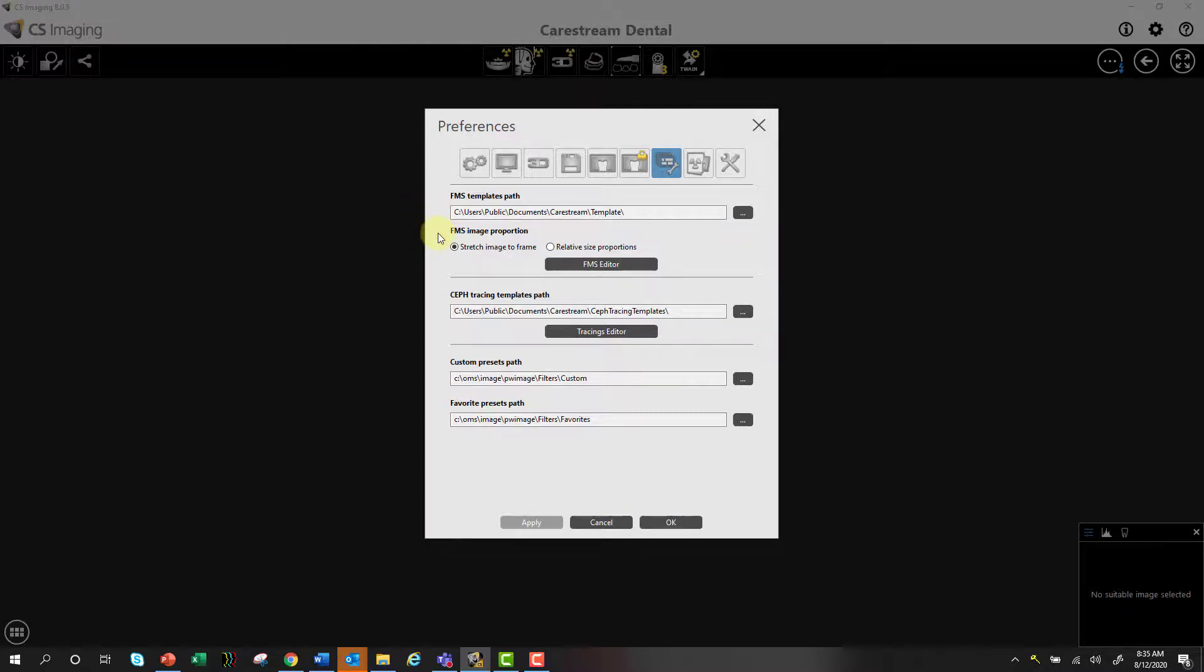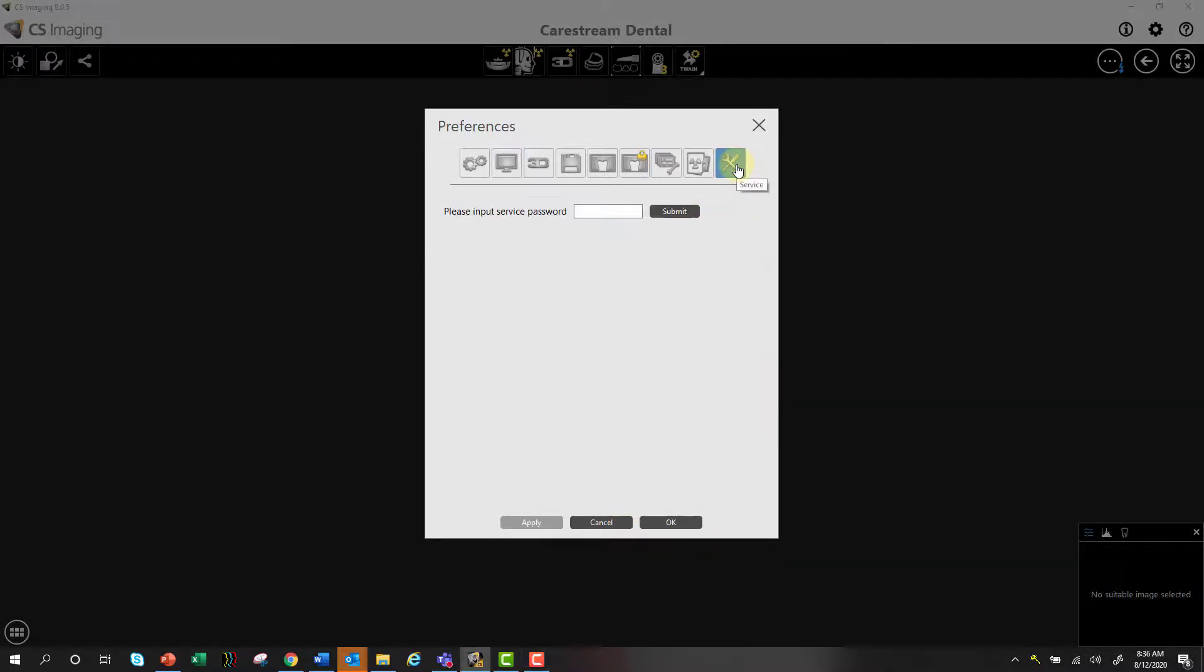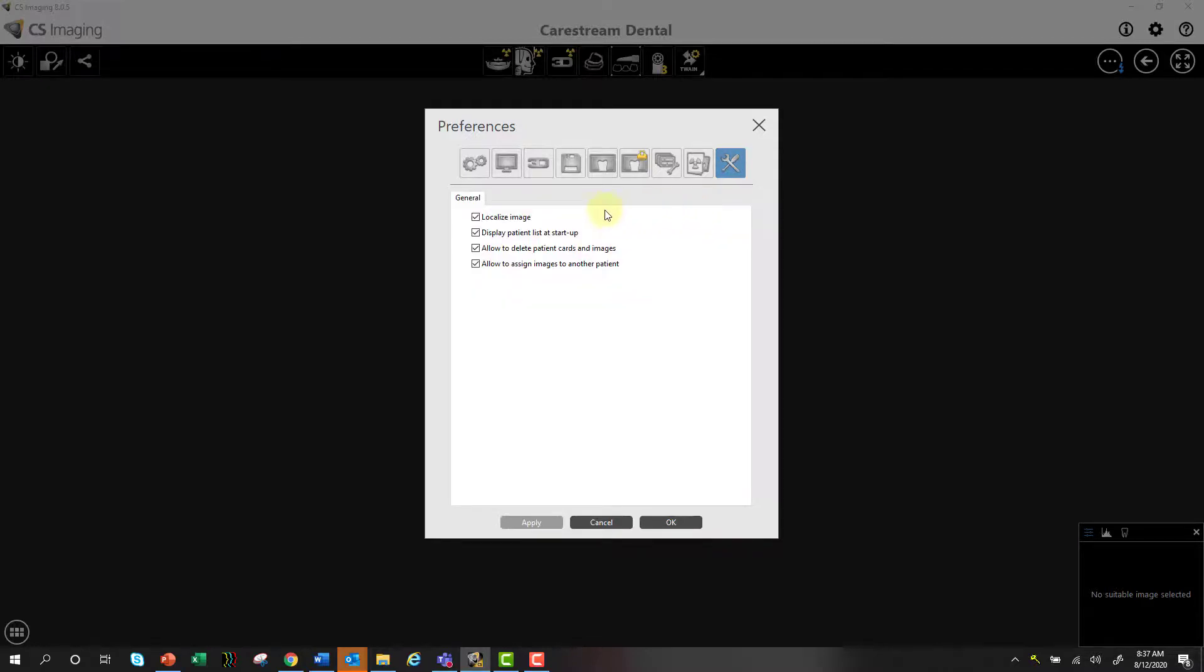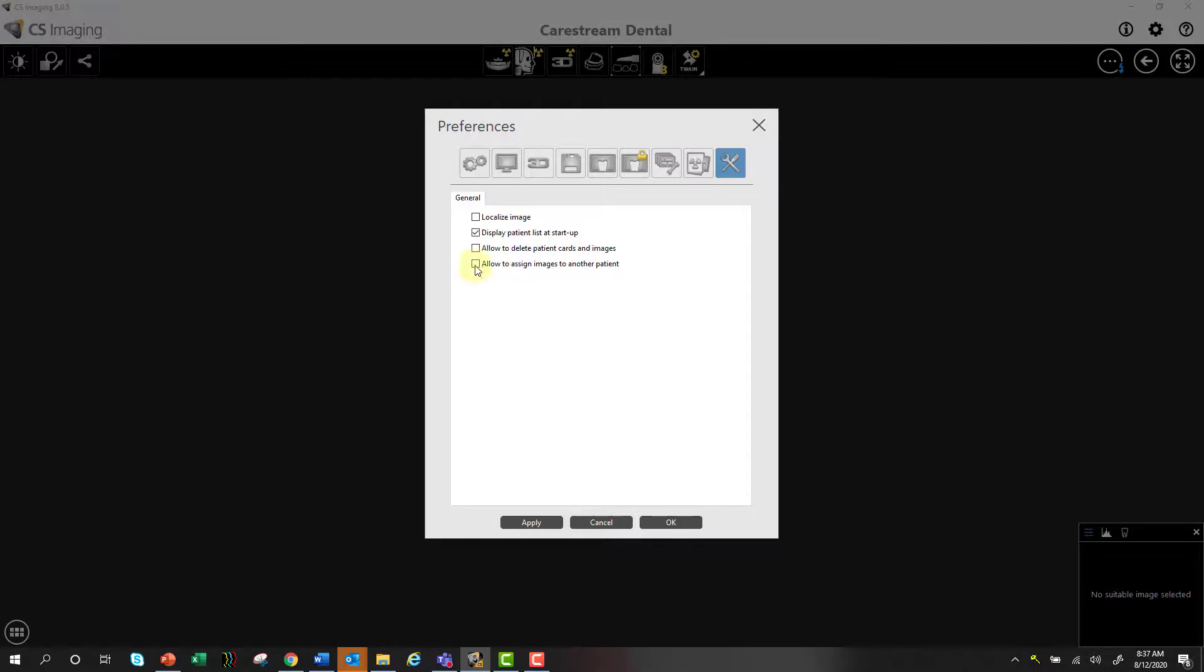And the last thing I'm going to show you in the preferences, at least for this particular video, is under the service tools, this password to input, which will populate some additional options for you. So the password is 2748, which stands for CSI 8 if you looked at your phone, for example. So 2748, and then you select submit. And now I've got a few other options. Now, these are not selected at default. I believe this one is at default, and I'll go through what these are, or a couple of them at least for now.